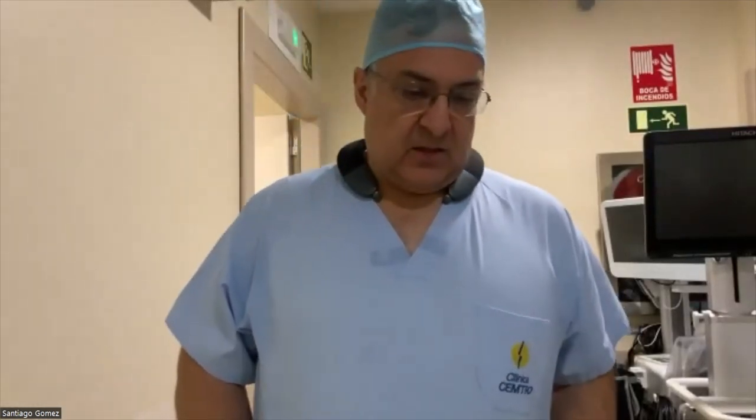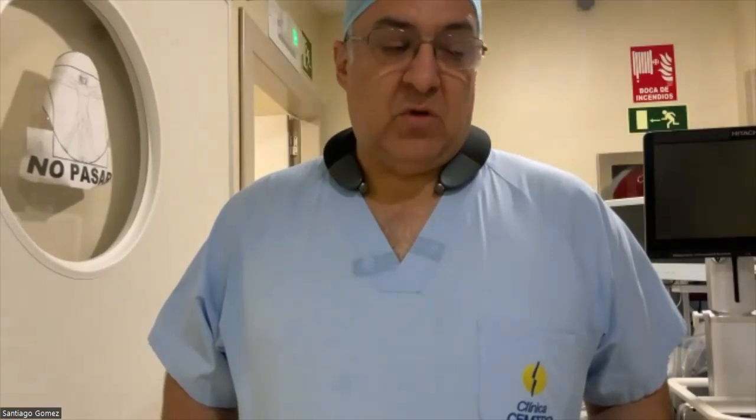Good. Yeah, I agree. Of course, holmium still has a big role, and many experts like Guido Giusti in Italy, for example, stone guys, tell you that they would never give away their holmium. They like thulium for particular cases. They like the dusting effect, but they wouldn't give away the holmium. And I do prostate.